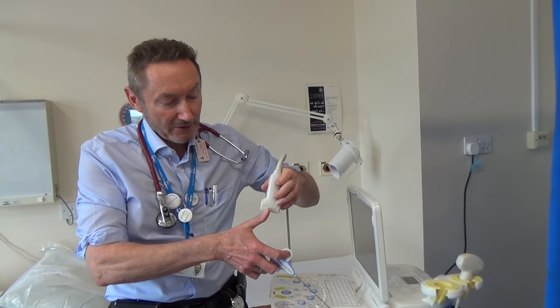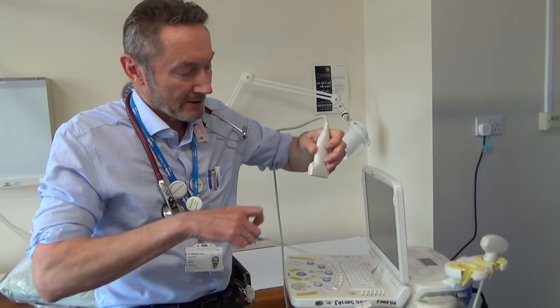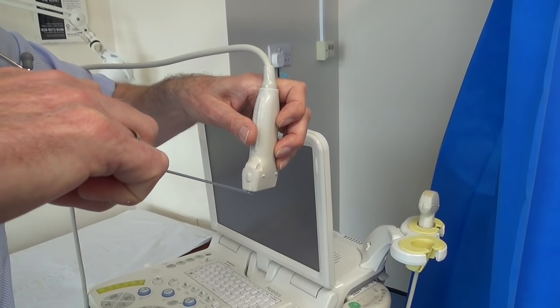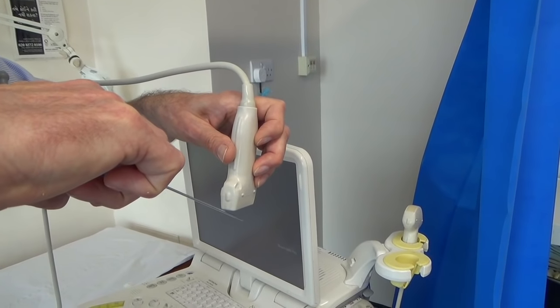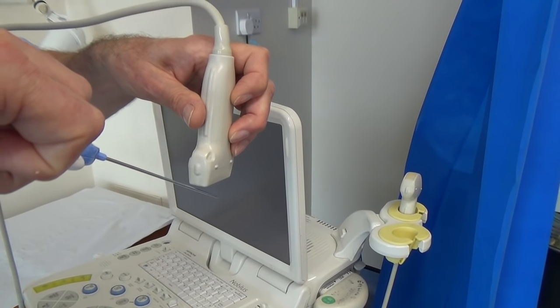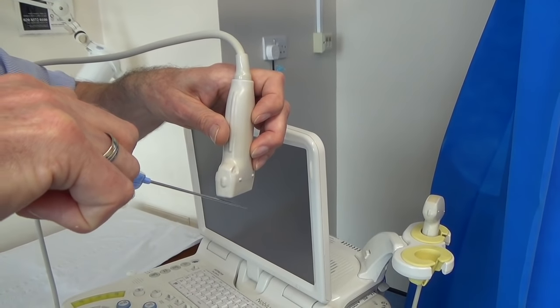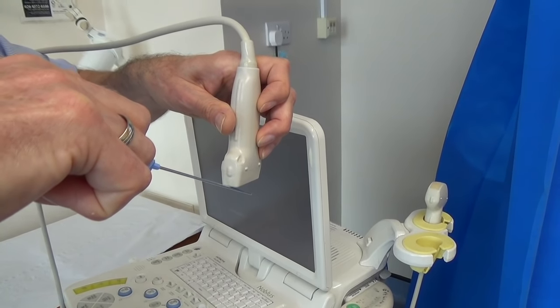To do the biopsy you'll be using a high-frequency linear probe to give you ultrasound guidance. The key here is the lining up of the needle with the axis of the probe. If this is on the skin, you want to put the tip of the needle exactly halfway between one side of the probe and the other, and make sure that it's lined up with and exactly parallel with the axis of the ultrasound probe. Pass the needle down and you should be able to watch it the whole way from tip to where it comes under the probe just under the skin. If you move the probe or the needle slightly to one side or the other you won't see the needle in its entire track at all, and if you angle the needle slightly off from precisely parallel with the probe you'll only see a short segment of the needle and the biopsy procedure won't be as accurate or safe.